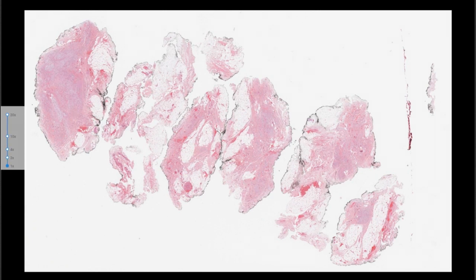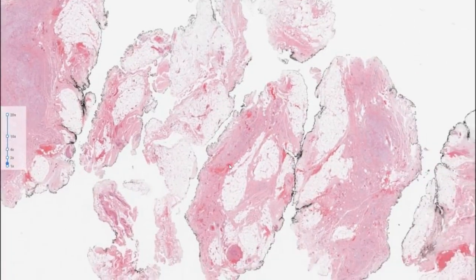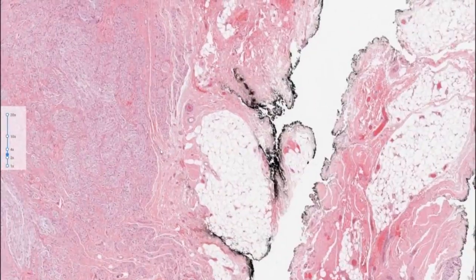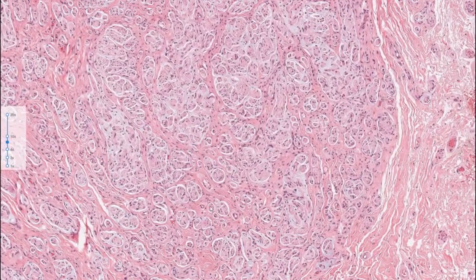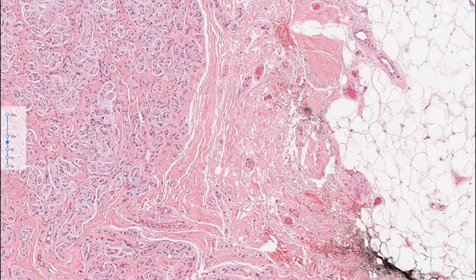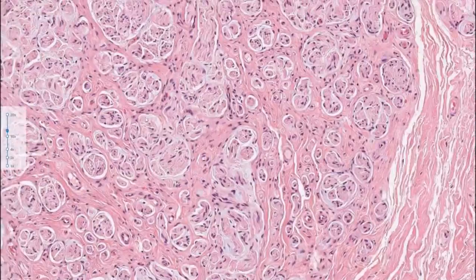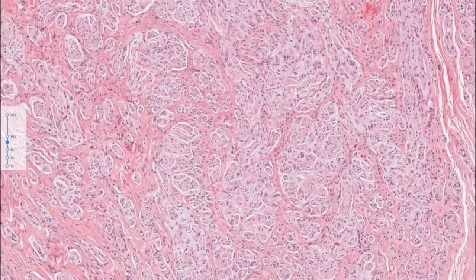And this is the scan slide. It's an excellent representation of this pathology. This is what you have. You have a variety of components. You have connective tissue. It's important to distinguish that from peripheral nerve, which are all these little fascicles here. And you see it's a dramatic expression of these little fascicles intermixed with fibrous tissue.